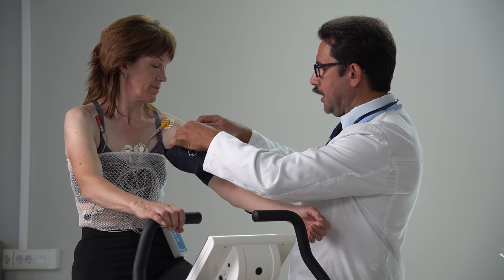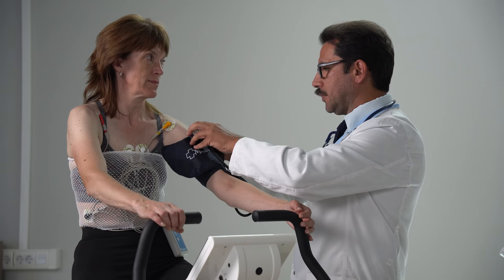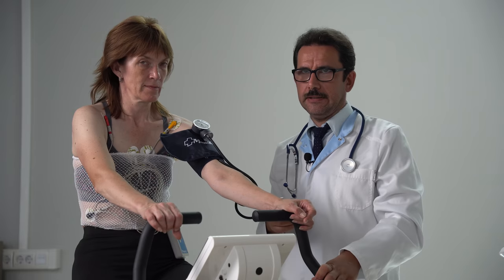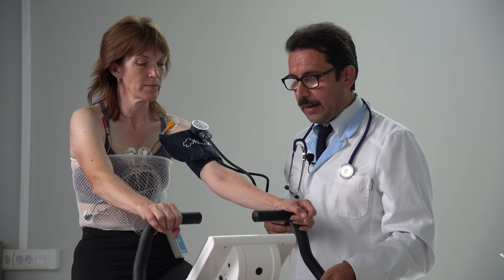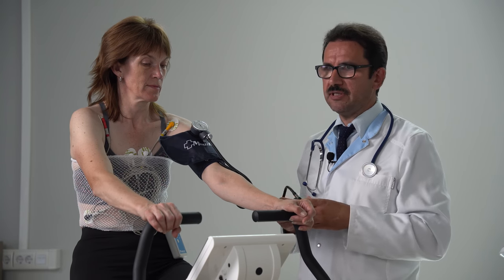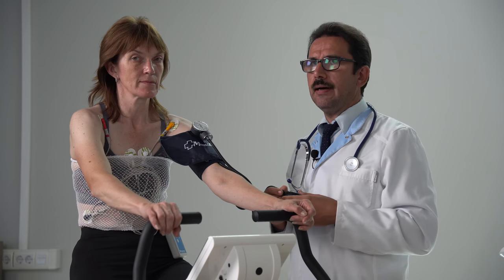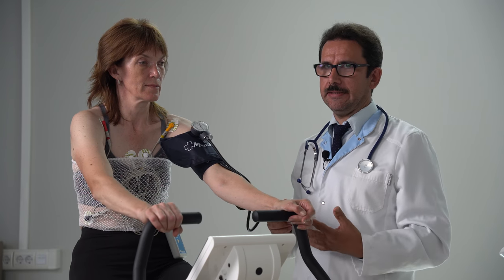Why not to save some money? Because, yeah, we can have the system with a special electronic module that measures blood pressure during exercise. But yeah, it's very expensive, I say. And you cannot use conventional blood pressure monitors that you may purchase from, for example, some pharmacy, because these systems are not designed for measuring blood pressure during exercise.